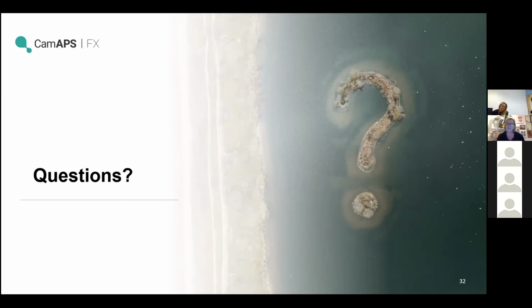And then there's another question on software updates, because obviously it's an app. So how does that happen? It's a great question. So we release new app updates periodically. Sometimes these are obvious and it'll be a new feature that appears on the app. Sometimes you may not notice it and it's something behind the scenes. Whenever there's a new app update, there'll be a notification within the app to suggest that you update.